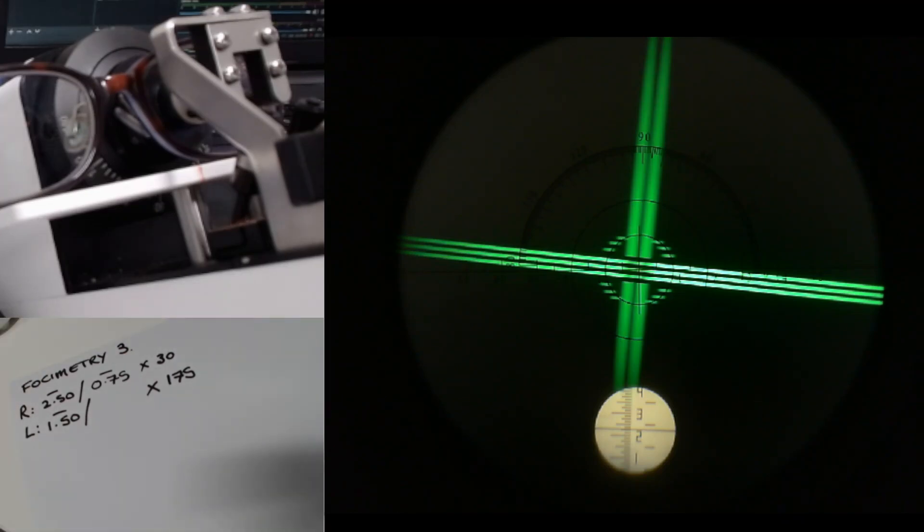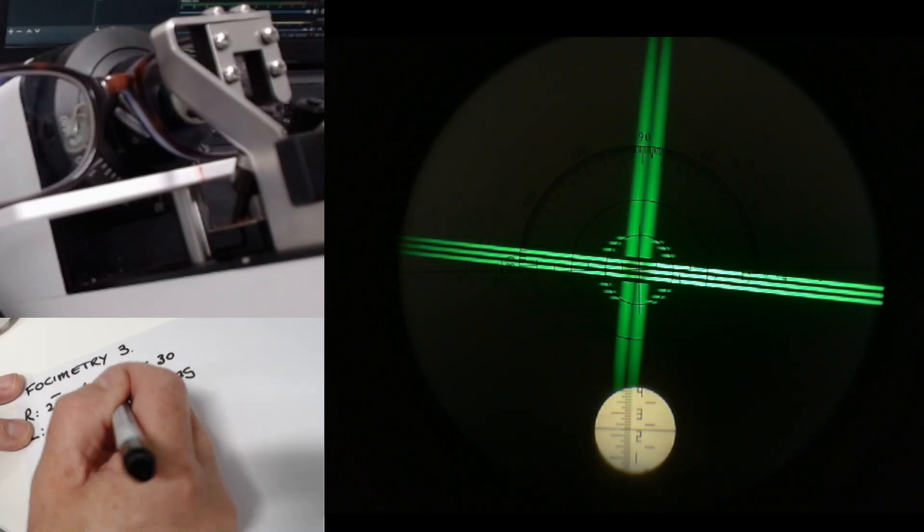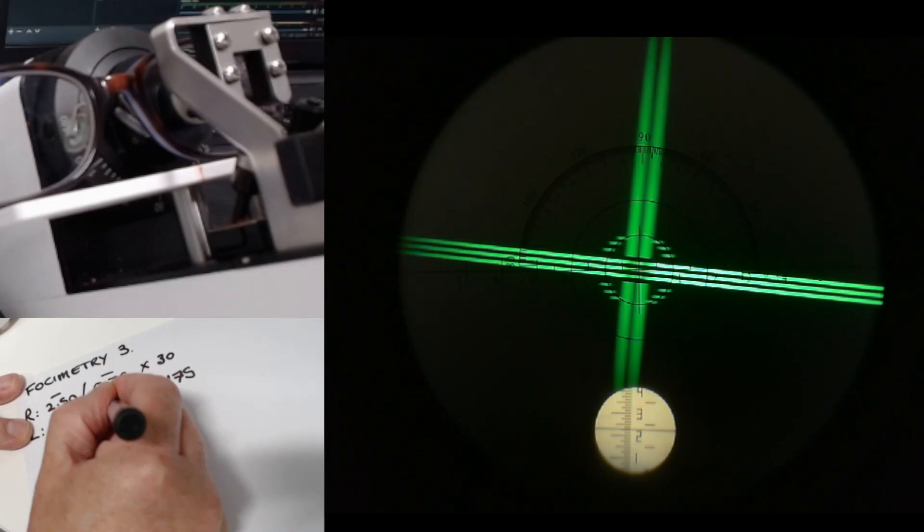We're going to say minus 2.25. So to get from minus 1.50 to minus 2.25 is minus 0.75.